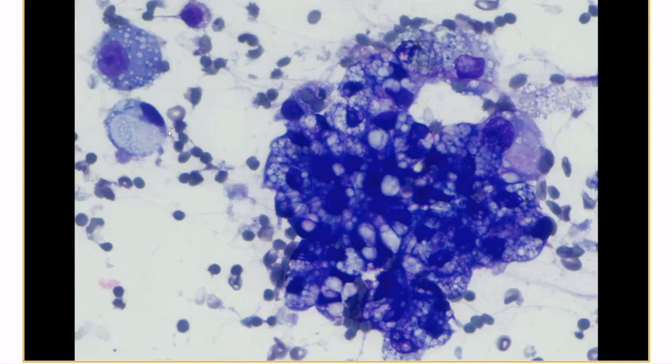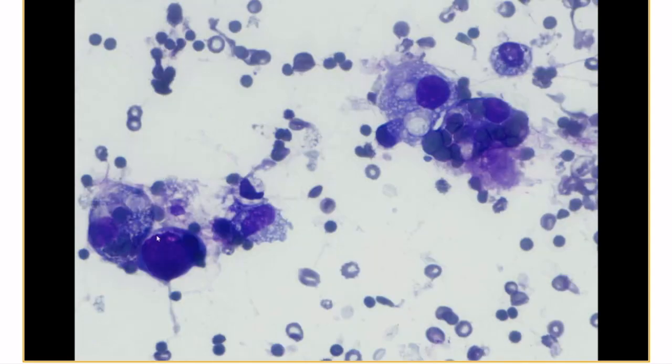Some of the cells may make you think they are histiocytes, but if you look really close, there is too much cytologic atypia for you to mix this up with a histiocytic process or histiocytes. Again, more cytologic atypia, and this degree of cytologic atypia is very concerning for a malignancy.